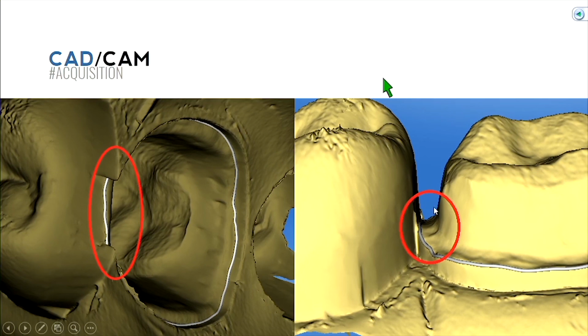What did we have to do once we got the casts poured up and Pindexed? We had to trim the die, and before we can trim the die and remove the die, we had to section that prep. Remember the video, they took a little blade and went in between the teeth and started to saw it. So when you got your cast back, you noticed that it was already separated because somebody had sawed the die off. Well, if you don't have room there for that saw to fit through, you're not going to be able to do that accurately.